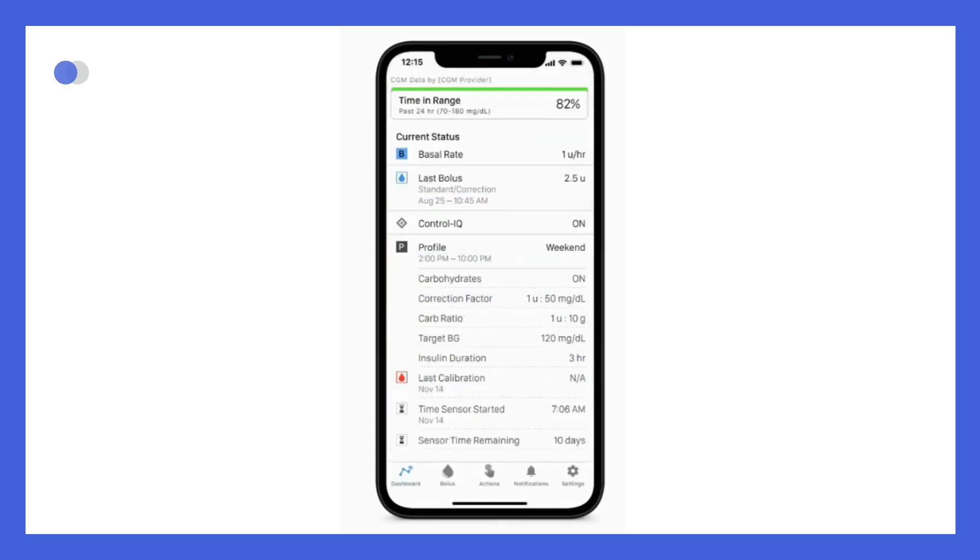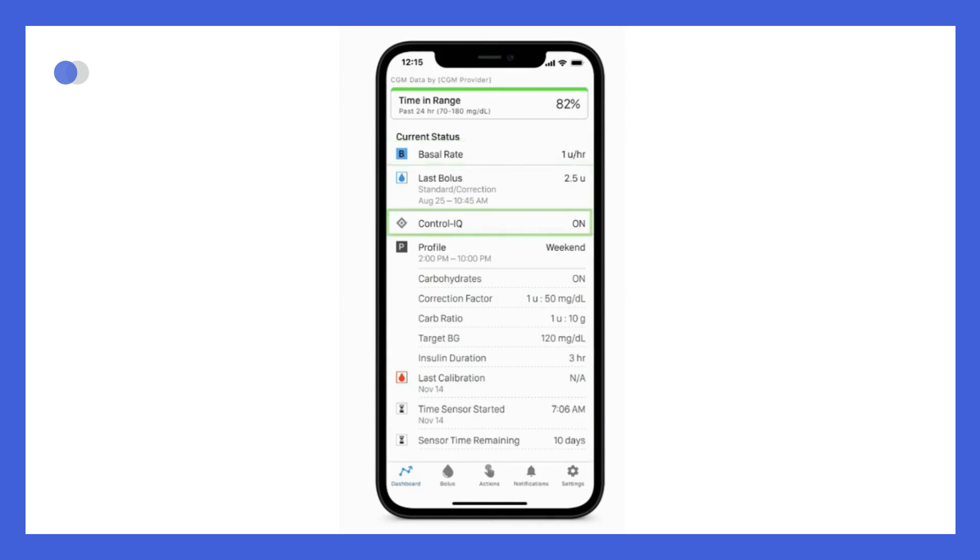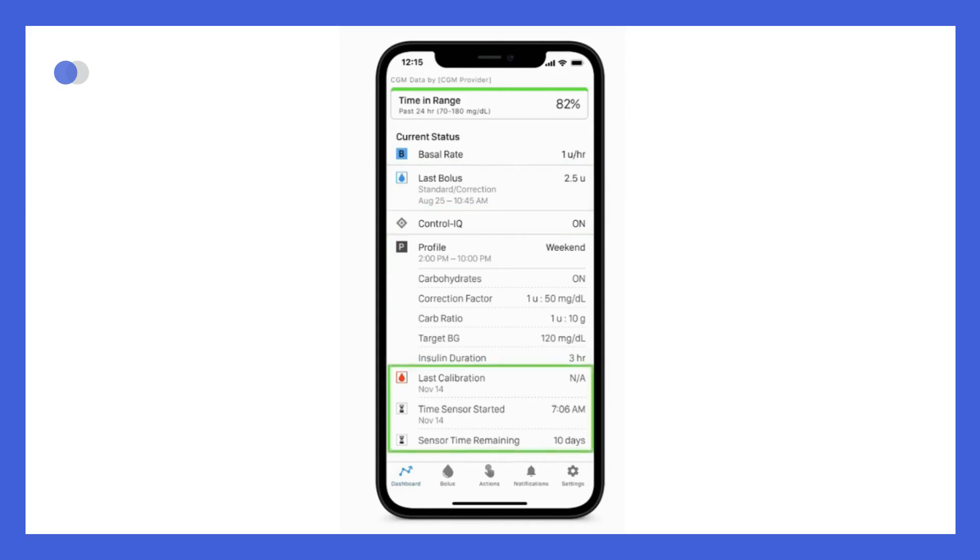When you swipe up, you find the current status of the pump. At the top, the current basal rate is displayed. Information on the last bolus delivered is shown here. You see the current status of Control IQ technology. Next, you see the settings for the active personal profile and beneath that you see the status of the CGM system, which may vary by sensor.